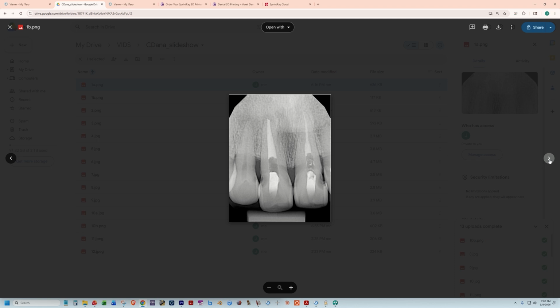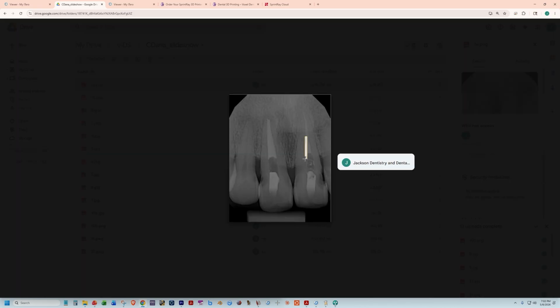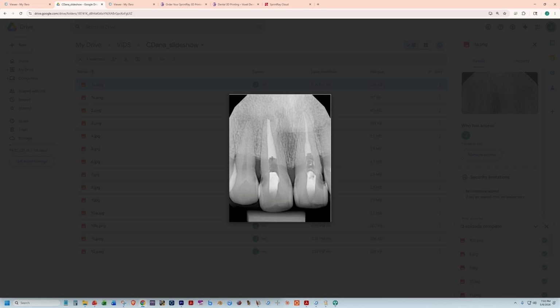And then when she came in for the crowns, I found the teeth to be too badly decayed and not restorable. Okay, so then we changed our treatment plan. What we did was we made a treatment plan to extract these two: extraction, cone beam, surgical guide, implants, two of them, abutments, crowns, the whole deal. All right, so we just subtracted the amount that she spent in the endodontist's office from her implant treatment plan, and she was happy with that.